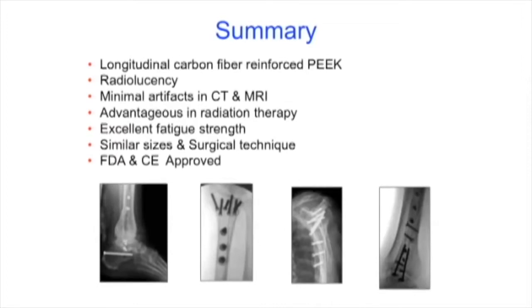Actually, no, I had one experience with it, not directly though. I had one patient who had a C3 type mid-shaft femur fracture that I fixed, and she went to follow up in Illinois, and then her nail self-dynamized and her titanium screws failed.